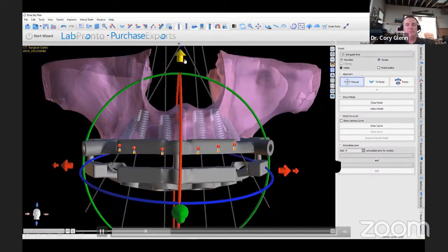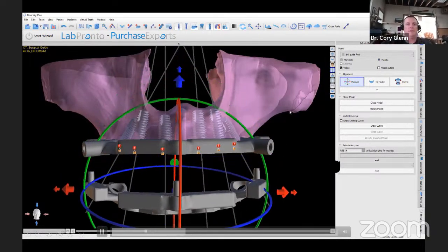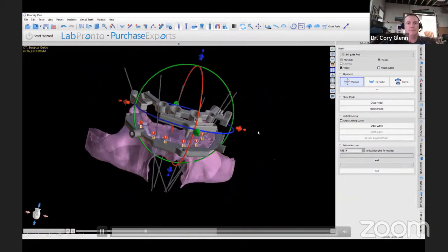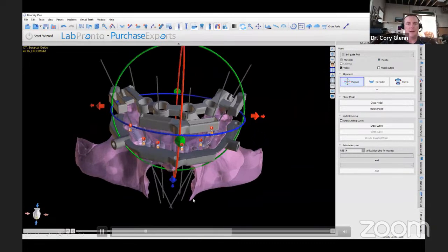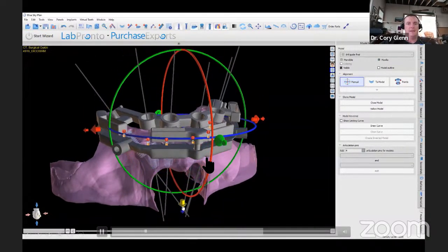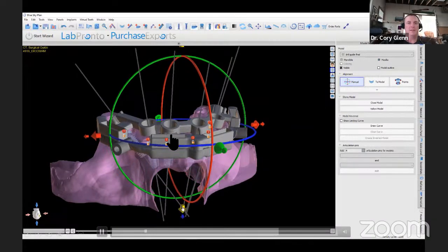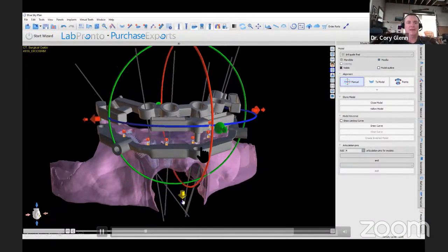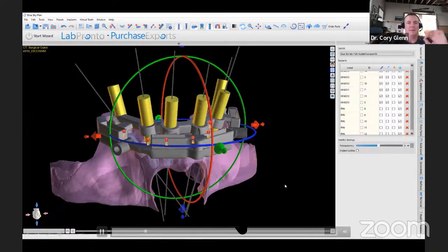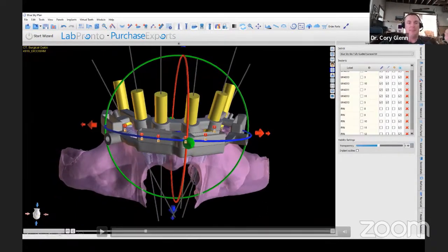So after you've reduced the bone down, you can throw on this drill guide. And again, you see the little peg that orients it. The magnets are just for retention. It's the tripod of male-female pegs that actually keeps the position there.